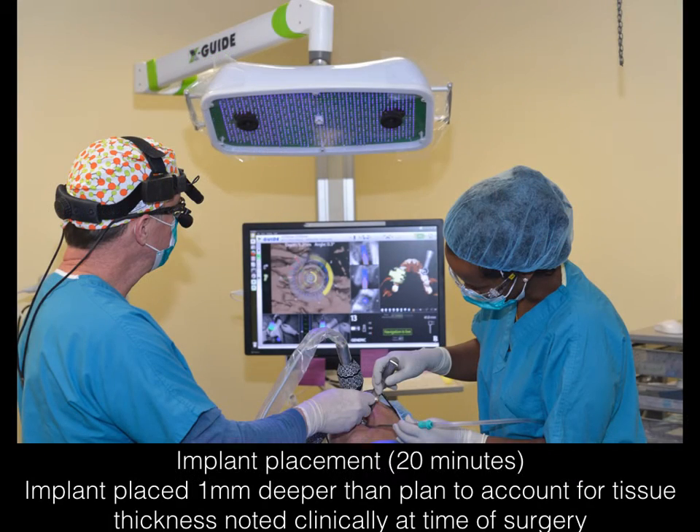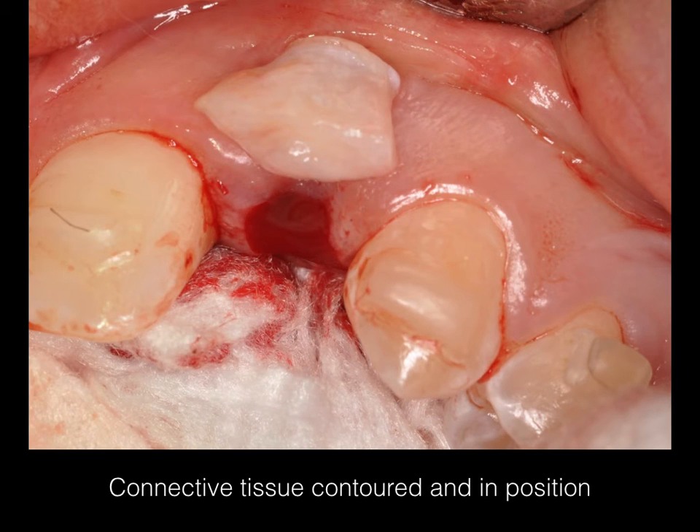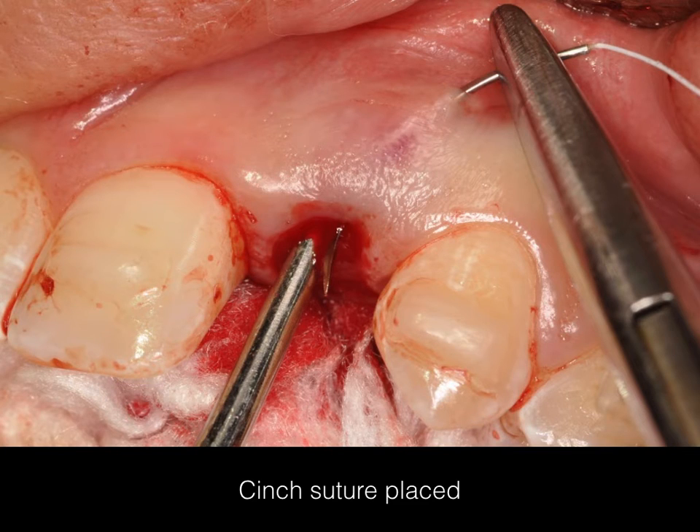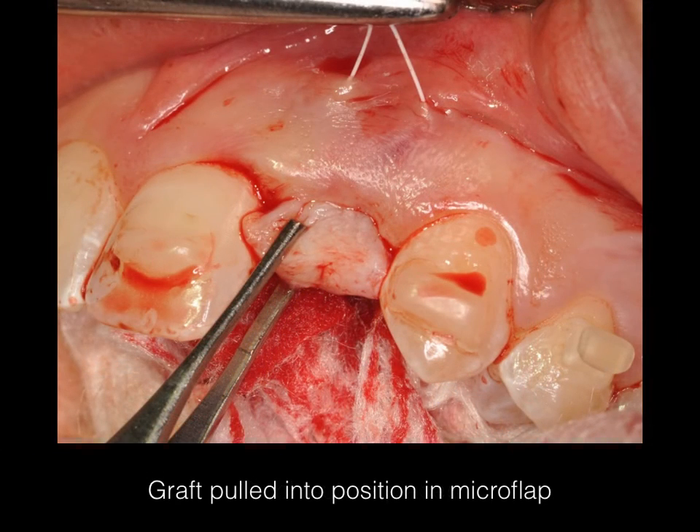This is a view of myself and my assistant in the surgical field, where I'm looking at the X-Guide. My first assistant is looking in the mouth and her job is to make sure the soft tissues are retracted appropriately. In this case, it took less than 20 minutes to place the implant. This is an intraoperative view of the connective tissue graft after it's been contoured. This is a view of the micro flap being developed using a number 15 blade and a sharp curette. This is a view of the cinch suture being placed through the micro flap and used to pull the connective tissue graft through.